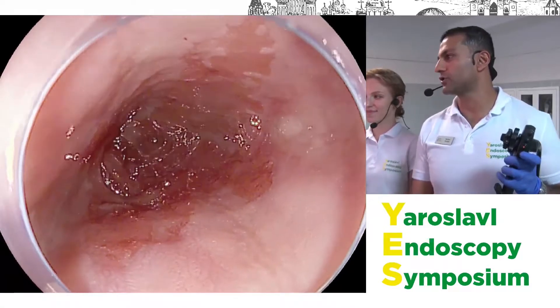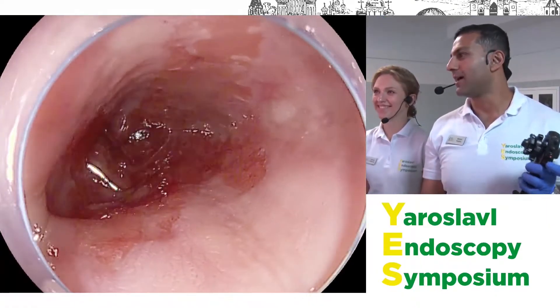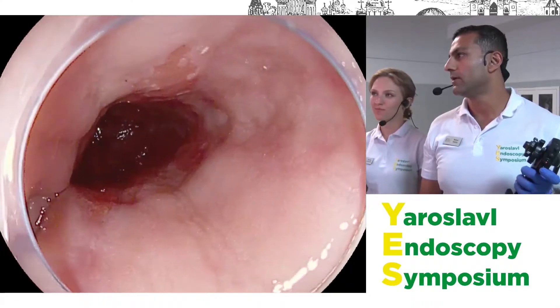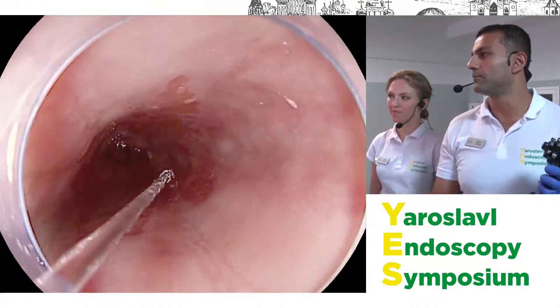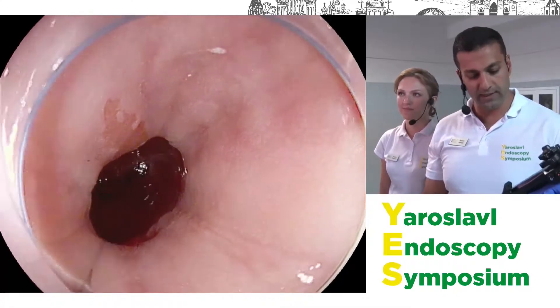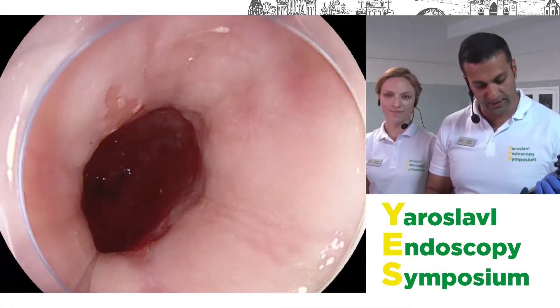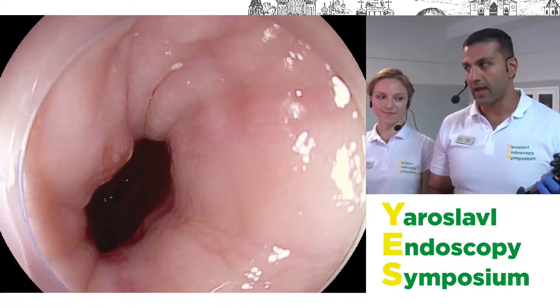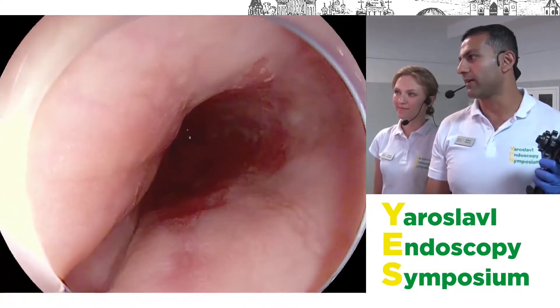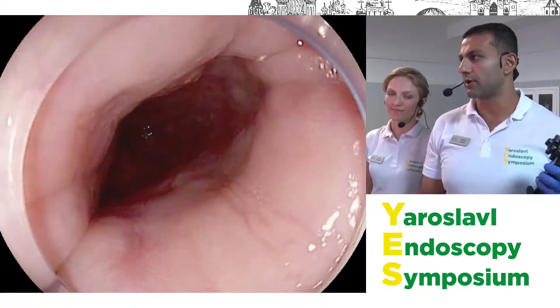You have heard the history from Natalia. This is a gentleman with Barrett's esophagus with biopsies that have shown dysplasia. I'll talk a little about the equipment I'm using: a Pentax magnification endoscope, the EG-2990ZI, using the new EPKI 7010 processor.